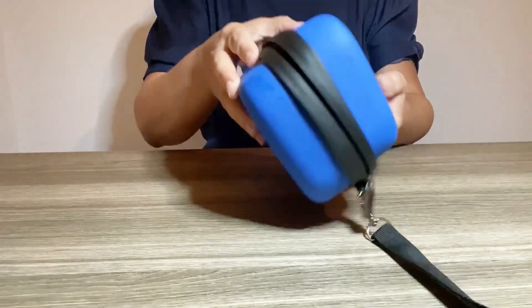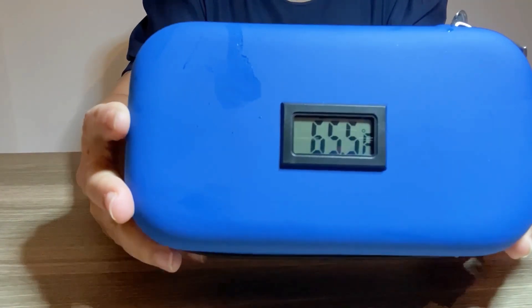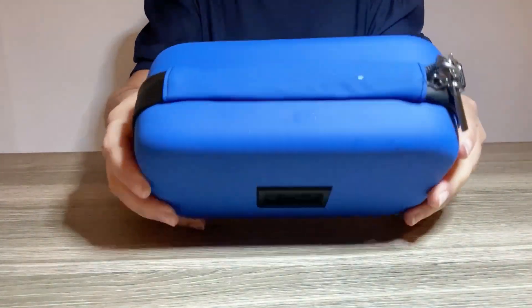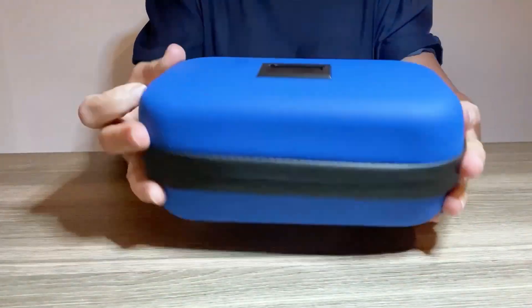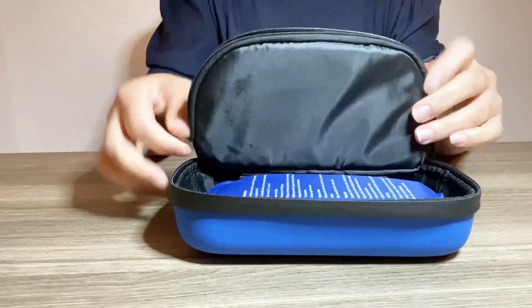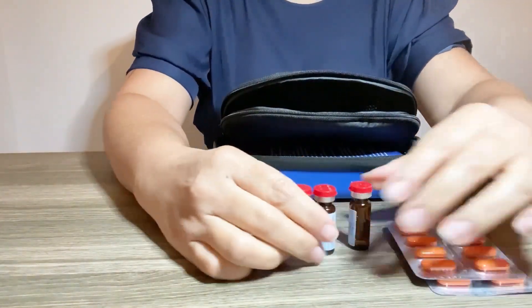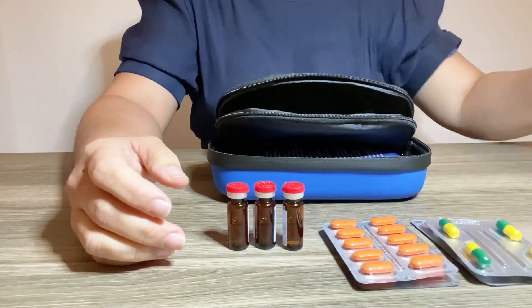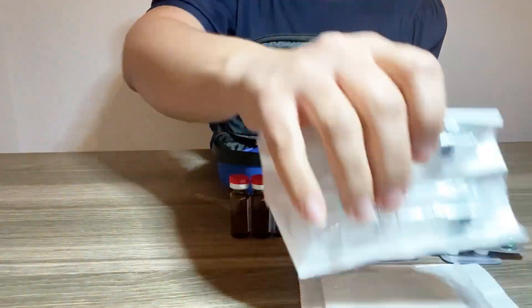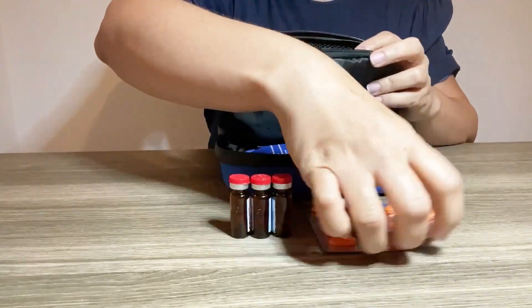Now let's see the temperature — it's dropping down to 65, 64, and it will continue to drop lower as the ice settles inside. We have a nice pocket where we can fit all of our medication. The syringes and insulin bottles all fit in nicely and conveniently.